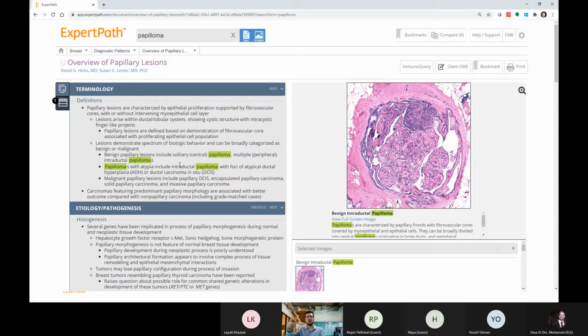So if I look for a specific detail of information, description, marker, my attention can be directed to that point where it's mentioned in the text, okay? In this case, it's an overview, so papilloma is described here several times, but as you can see, again, we have a very useful overview topic that even for fifth, sixth year students can be quite helpful.